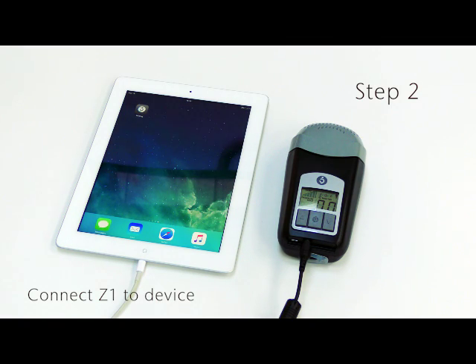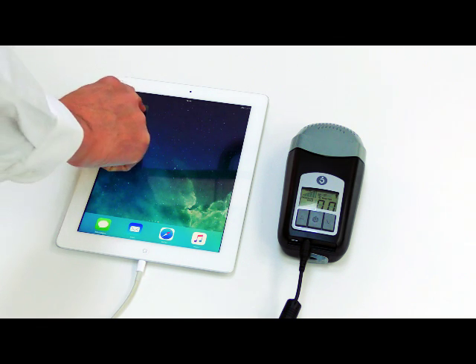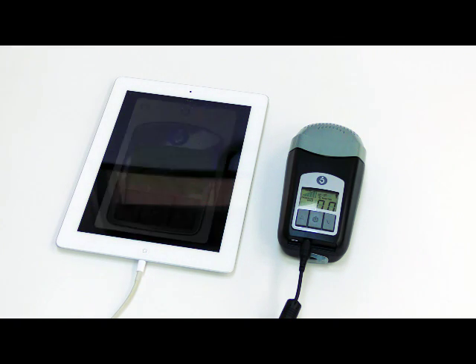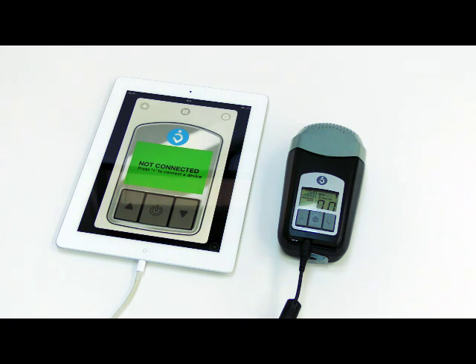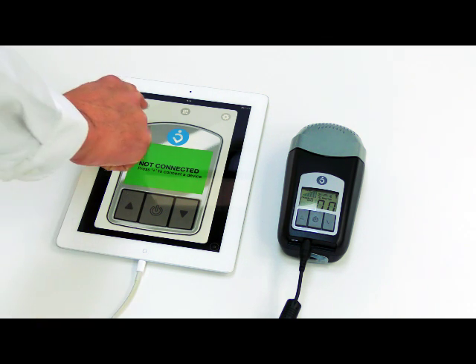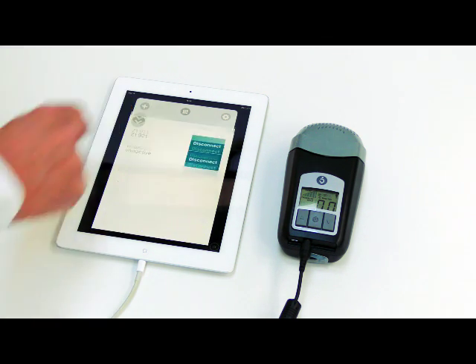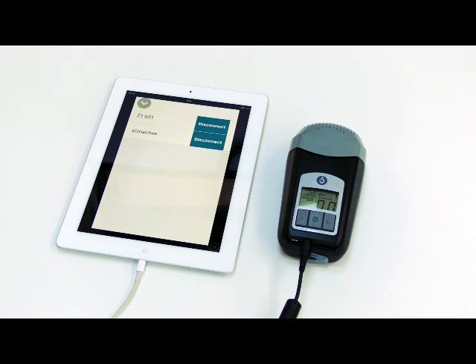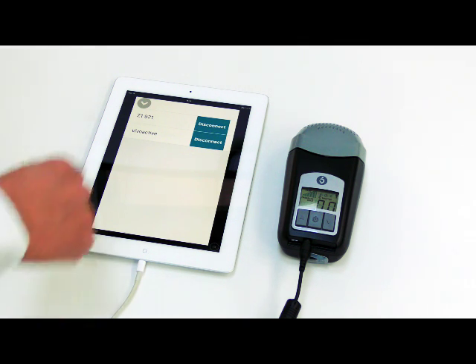Step 2: Connect Z1 to device. When the Z1 is in startup mode, showing 0.0 on the screen, launch the Night Log app on the mobile device. Press the plus sign button on the upper left hand corner of the screen. The serial number of your Z1 will appear. Press the number to select it.